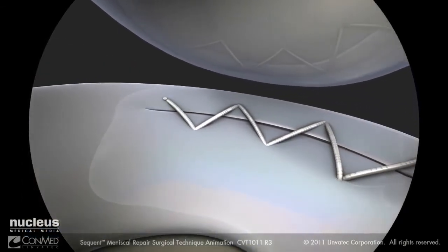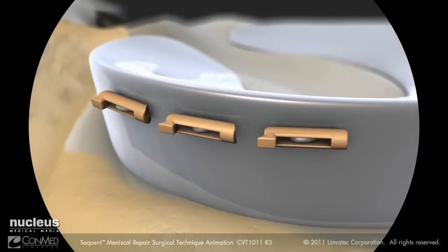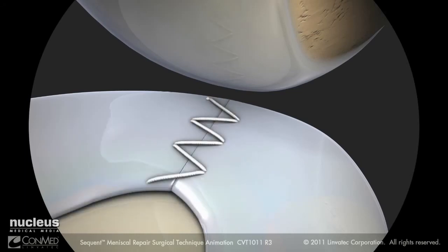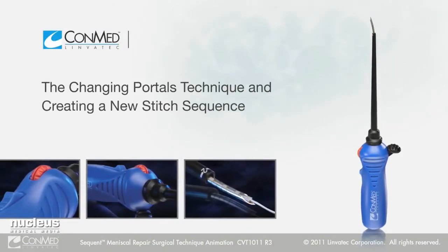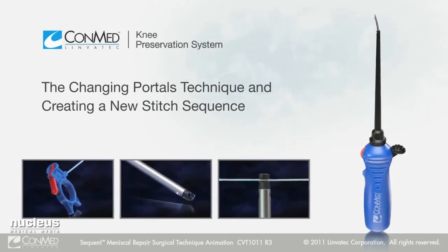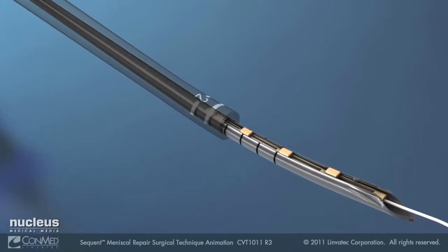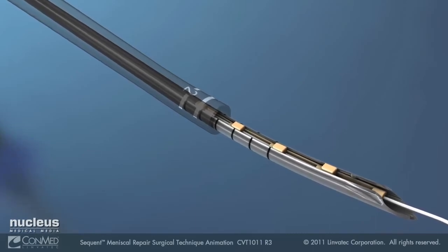The stitch configuration shown here is the sequential meniscal running stitch. The most important benefit of the sequent meniscal repair system is its multiple sequential stitch capability, providing the versatility to fix numerous types of repairs. The sequent meniscal repair device allows the user to change portals or create a new sequence of stitches during the surgery and still use the same device. When using this technique, the user should ensure that there are enough implants remaining in the device to create the desired number of stitches. If not, a new device should be opened.